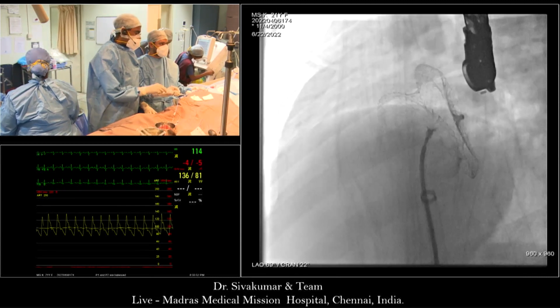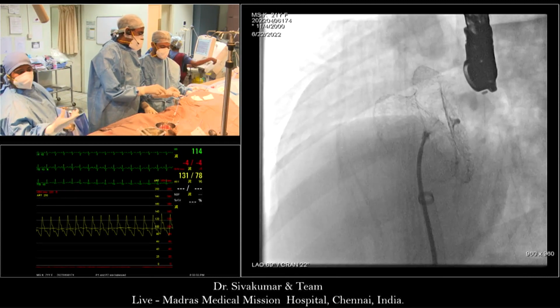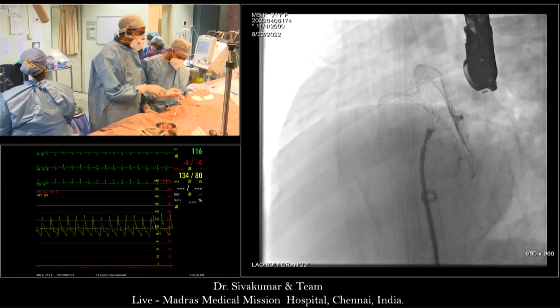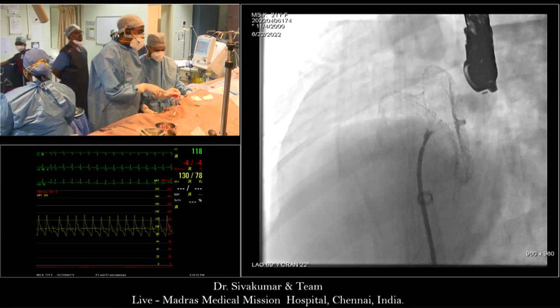What do we think about the waist of this device? Forget the micro for a second. Hands up says the waist is fully formed. Hands up. Waist fully formed. Okay. Waist not fully formed.